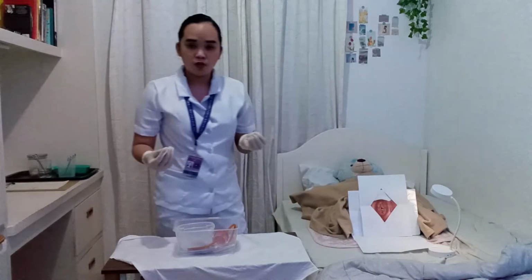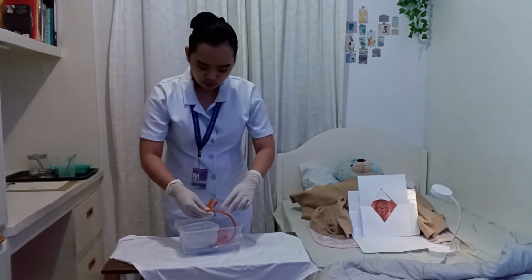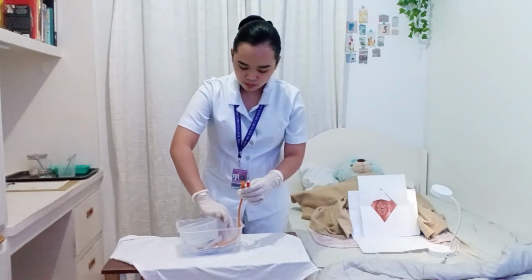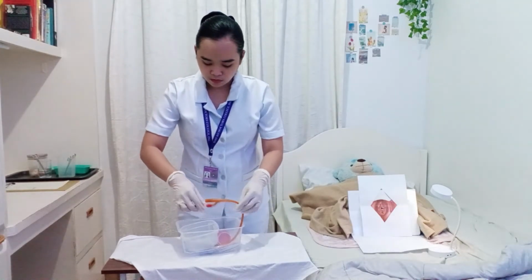And after that, we're going to connect the pre-filled syringe into the catheter.